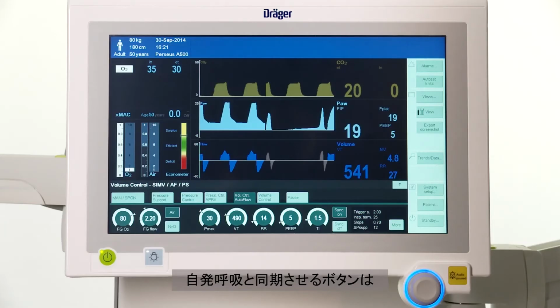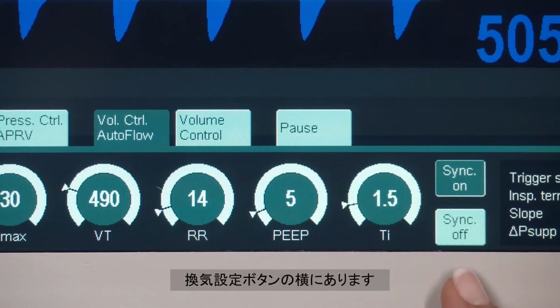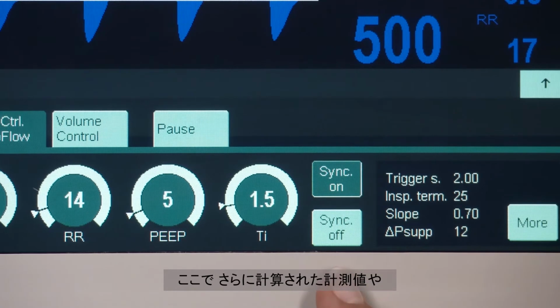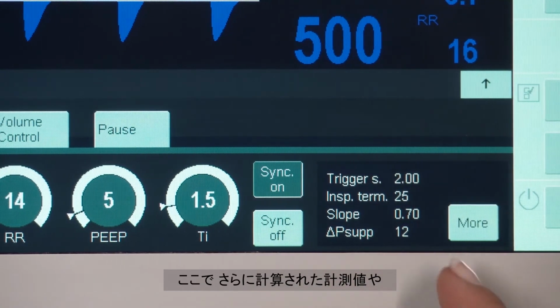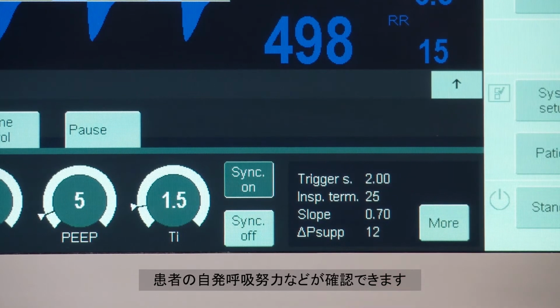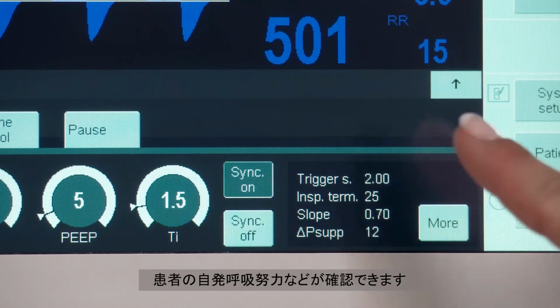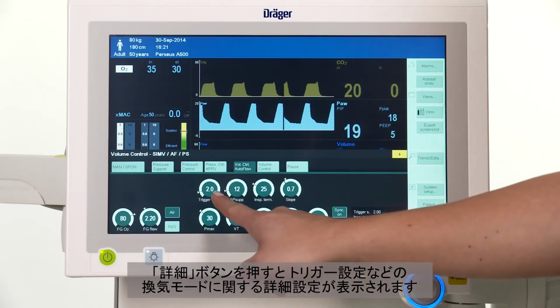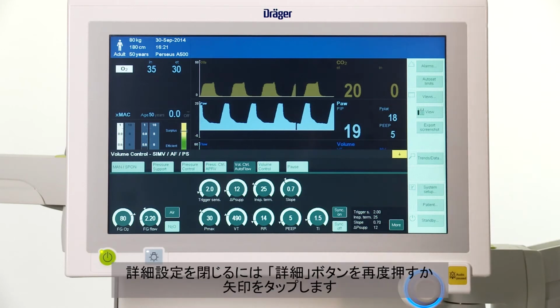The button for synchronizing the ventilation with the patient's spontaneous breathing is located next to the buttons of the therapy control. You will find further calculated ventilation parameters and an indication of the spontaneous respiratory effort of the patient here. Pressing the More button will open the advanced settings for the ventilation mode, such as the trigger setting. To close the advanced settings, either press the More button again or tap on the arrow.